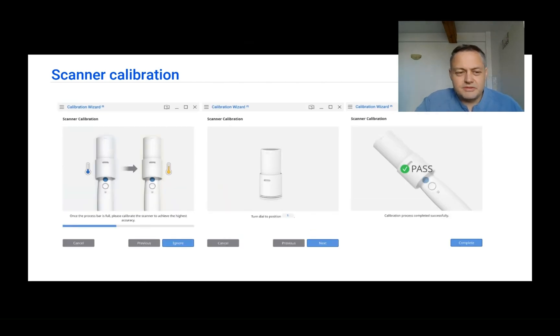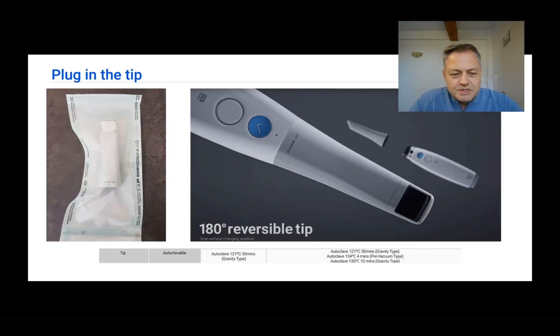On the left you will see the temperature and the heating indicator for the scanner. When it reaches the right level, everything is done and you can start. You proceed from position one to the last, and then the calibration wizard will tell you that the calibration is a pass.